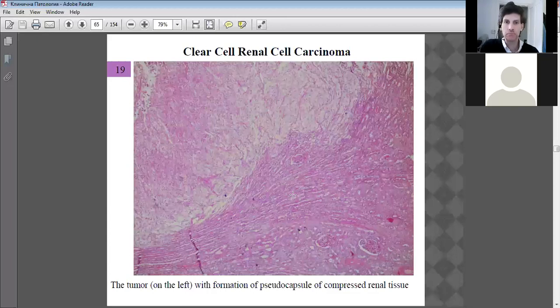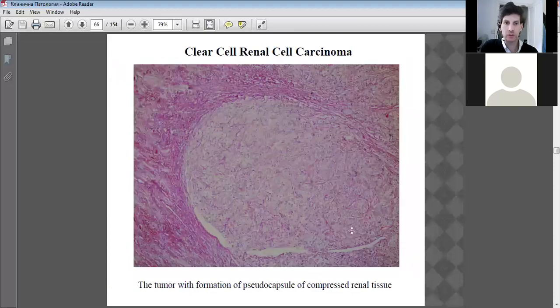Okay, good. It'll be interesting if we can see in the magnification some accumulation of fat droplets, because this can also occur in the kidney. Here's a very good slide of the attempt to isolate the tumor, and the fibrous tissue is massive around it. There's a distinct border as well. I can see that.